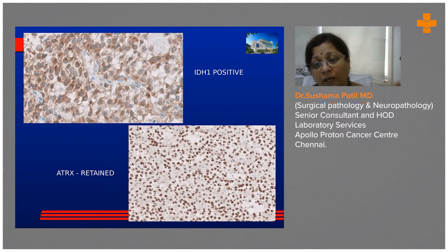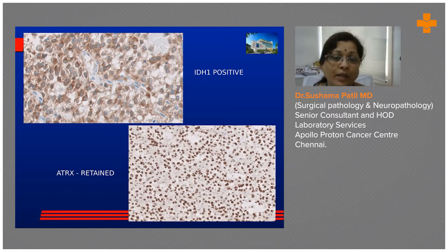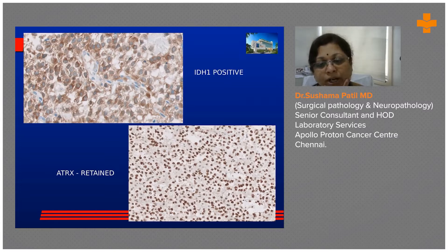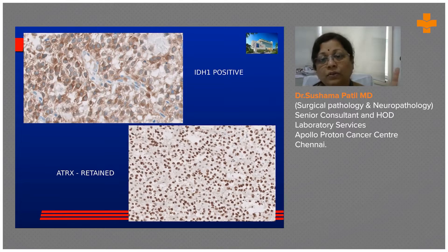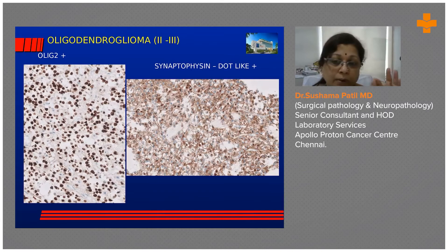To identify an oligo as an oligo, it has to be IDH1 positive and it will show retained nuclear ATRX expression — all the brown dots are retained ATRX expression. IDH1 is leading the glioma world now as a driver mutation commonly seen in gliomas. You can see IDH1-positive cells with brown cytoplasmic staining expressing the IDH1 epitope protein. This IDH-positive tumor with oligoid morphology shows retained ATRX expression, in contrast to astrocytoma which shows loss of ATRX. Remember: IDH-positive, ATRX lost = astrocytoma; IDH1-positive, ATRX retained = most likely oligo.